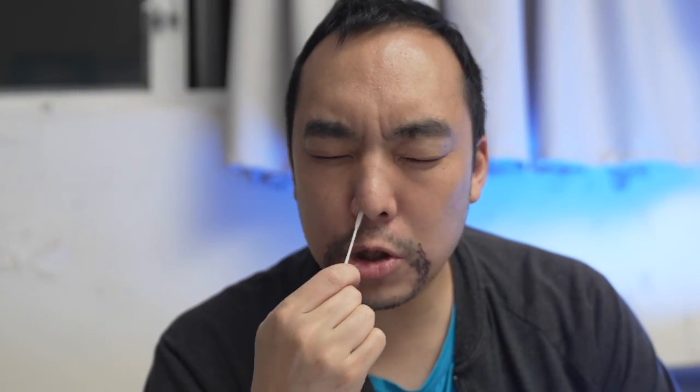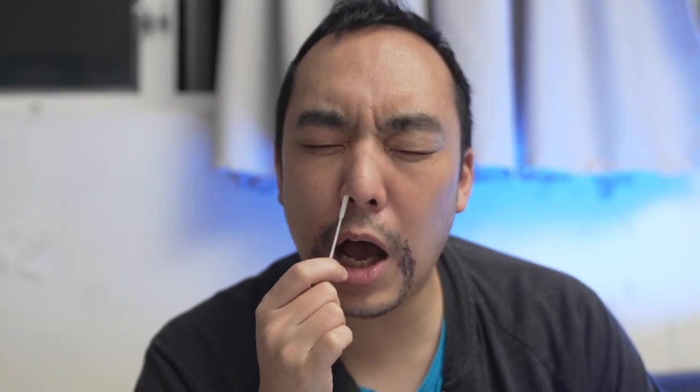It's not too bad. I had the one where they stick it down your nose and then goes all the way down to your stomach, and that one, it was horrible. But this one, it's a little bit itchy, but it's not more itchy than other stuff. But you need to go deeper. You need to go deeper until it feels sore. It hurts. Yeah, it hurts. I know. That's how they did it.